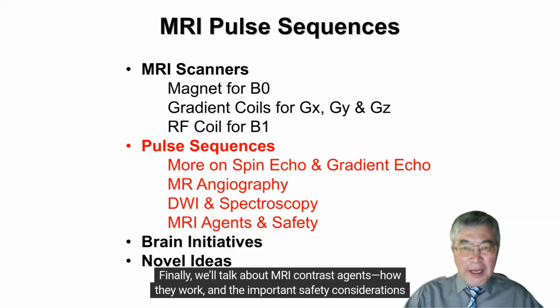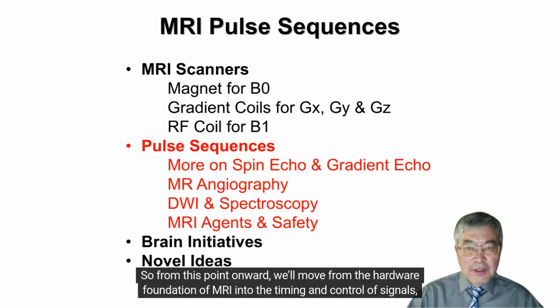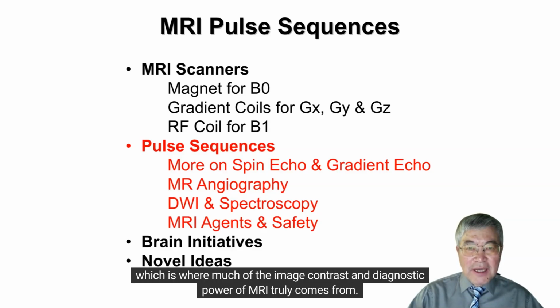Finally, we'll talk about MRI contrast agents, how they work, and the important safety considerations associated with their use. So from this point onward, we'll move from the hardware foundation of MRI into the timing and control of signals, which is where much of the image contrast and diagnostic power of MRI truly comes from.